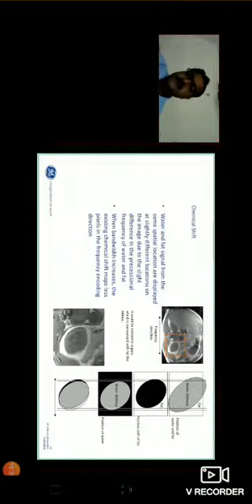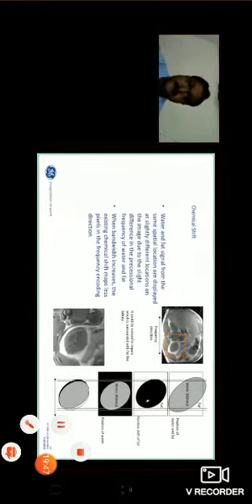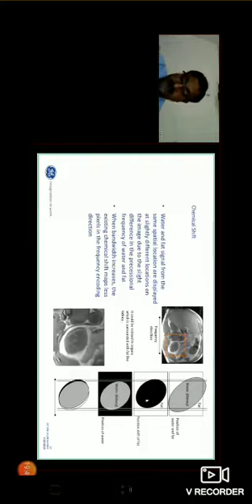Here, the water protons are surrounded by the fat protons. The fat and the water protons resonate at different precession frequencies. The fat frequency may shift and it may appear as a dark rim artifact, something like this, on the image. It's called the chemical shift artifact.